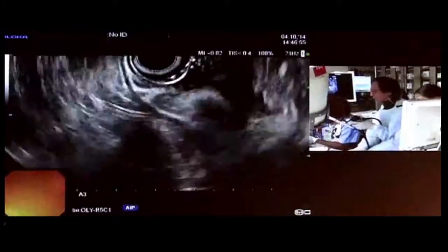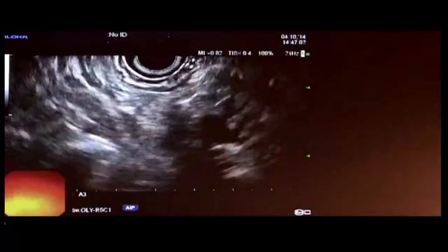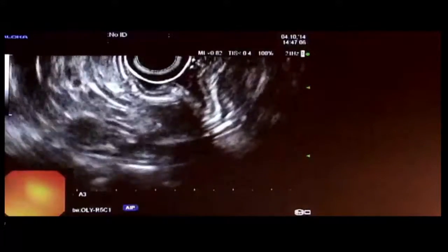All right, so now we've moved the patient. Now we just need to check the fluoro, and as soon as the assistants are out of the way, we'll do that. All right, so we're just going to think ahead in terms of what we need here.